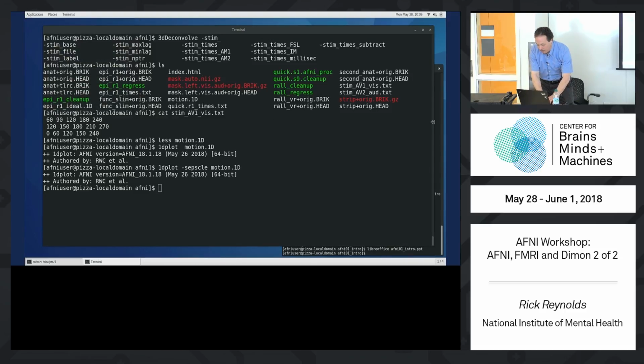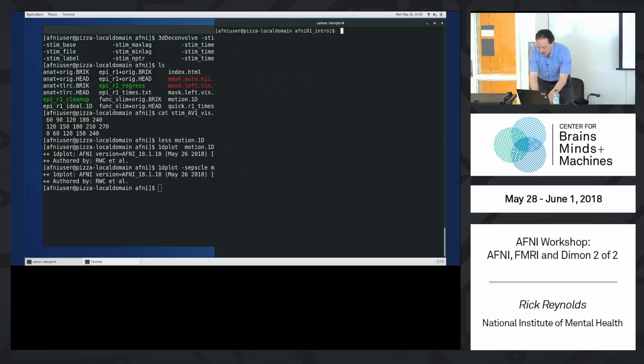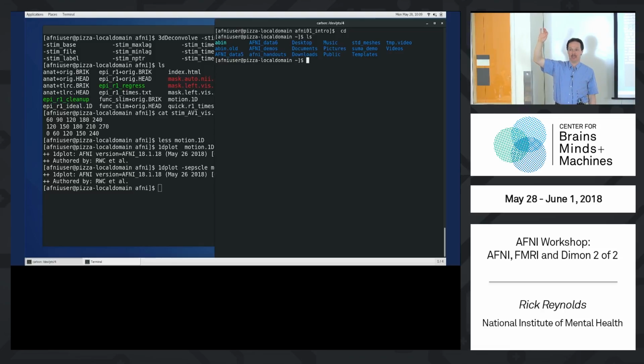So let me leap over to, let's talk about Dimon briefly. Is your data acquisition here for the most part automated? How many people actually analyze data? Do you have to handle DICOM files, or do you go straight to NIFTI or something like that? How many people handle the DICOMs? Okay, most of you. So this might be worth chatting about a bit.